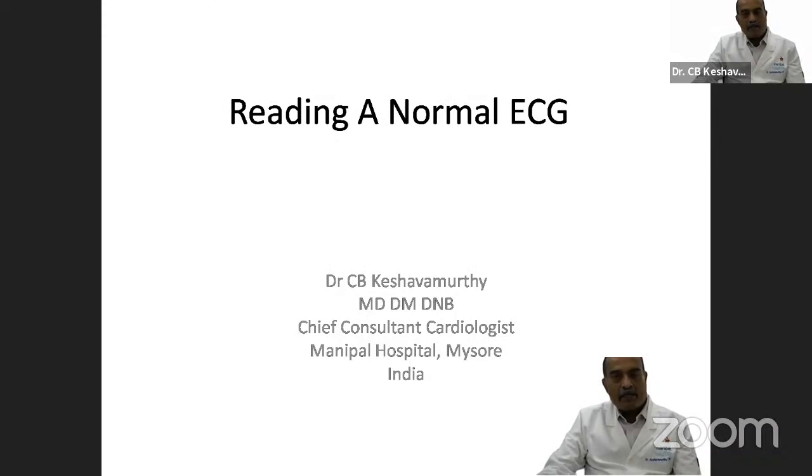The basic idea of taking an ECG and seeing an ECG and understanding it is to diagnose heart-related problems, especially if there are acute events like myocardial infarction or ischemia or unstable angina. We should be able to make out whether there are changes on the ECG and whether any urgent treatment is required, because in cardiology, as you all know, time-dependent treatment saves a lot of lives.